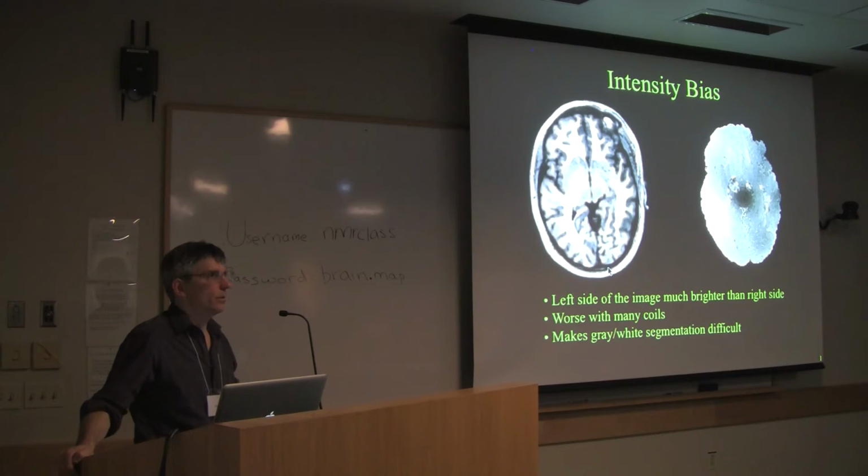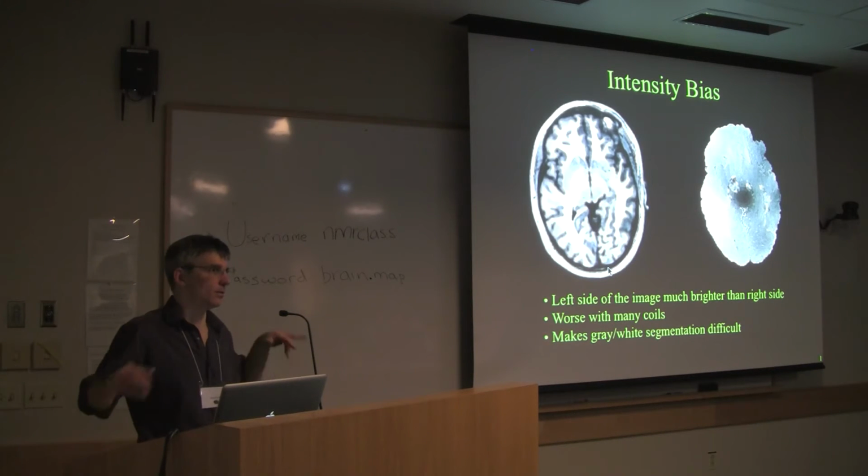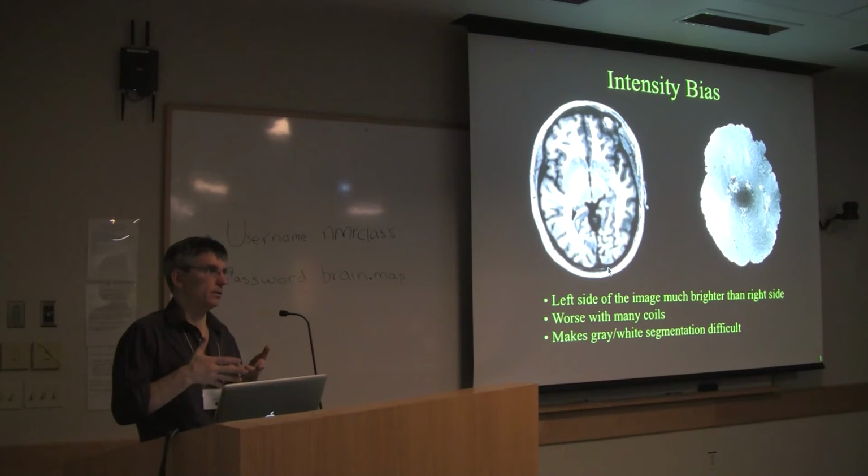So the question has to do with when you're dealing with older subjects who have white matter lesions. And so what it appears that I'm suggesting is that you go and redeclare those lesions to be white matter. But this is not actually what's happening. This is the WM.mgz, which, as I mentioned in the first talk, this white matter segmentation, is somewhat misnamed. It's supposed to be everything that's inside of the cortical surface. And so that's what we're calling the white matter segmentation here. So in this case, all we're doing when we edit the WM.mgz is saying, this should be inside of the cortical surface and not outside of it, essentially.